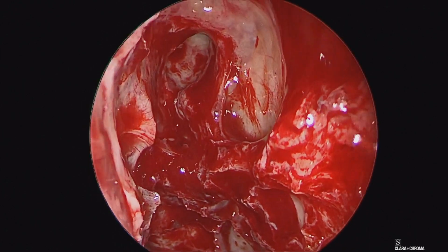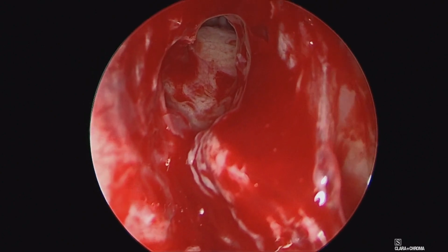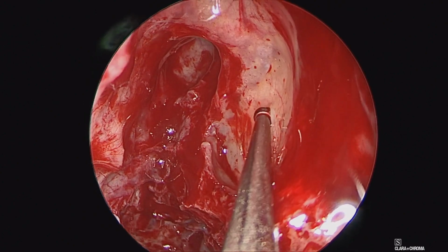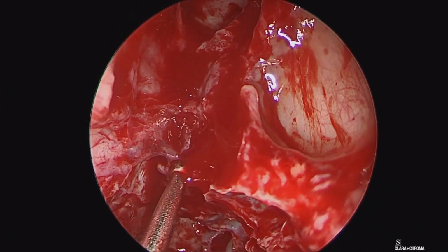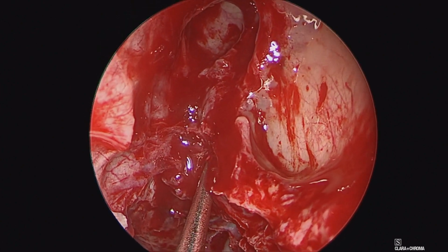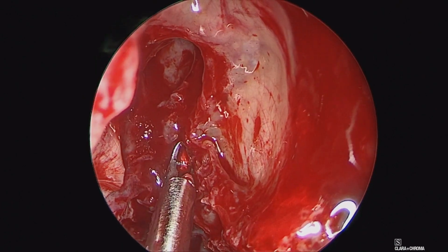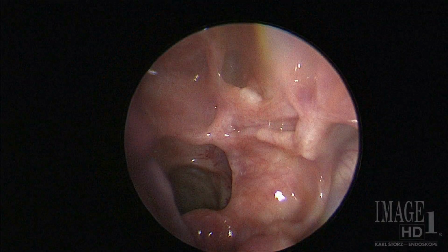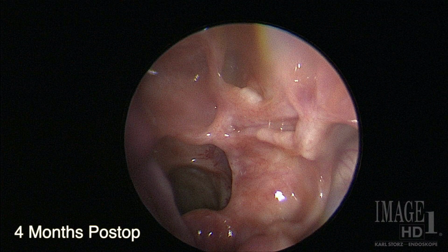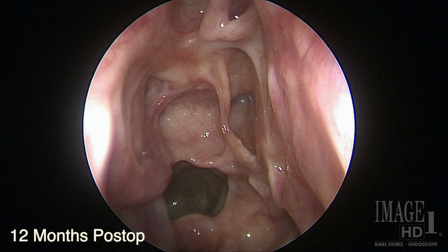And now visualizing with a 30-degree scope into the frontal sinus itself on the posterior table, as you can see there. And then just confirming our location along the orbit and identifying some additional supraorbital partitions in this area here, which we'll skeletonize to fully open up the area along the skull base as it transitions from the anterior ethmoid skull base into the posterior table of the frontal sinus. After that's complete, you can see we have some postoperative images of the patient 4 months after surgery and then 1 year following surgery, demonstrating a well-healed cavity with no evidence of inverting papilloma recurrence.